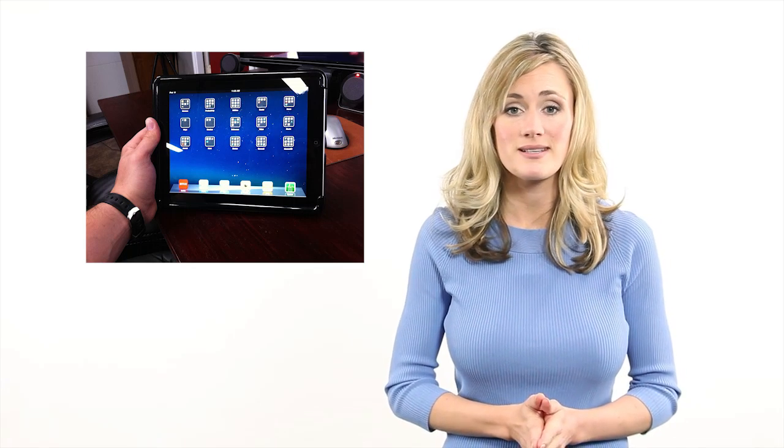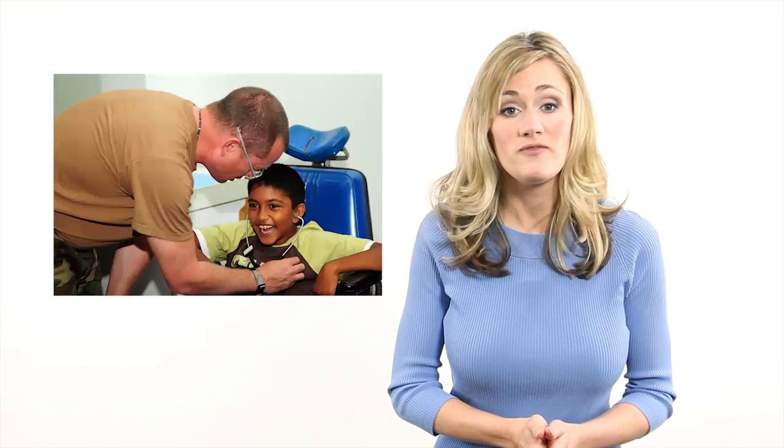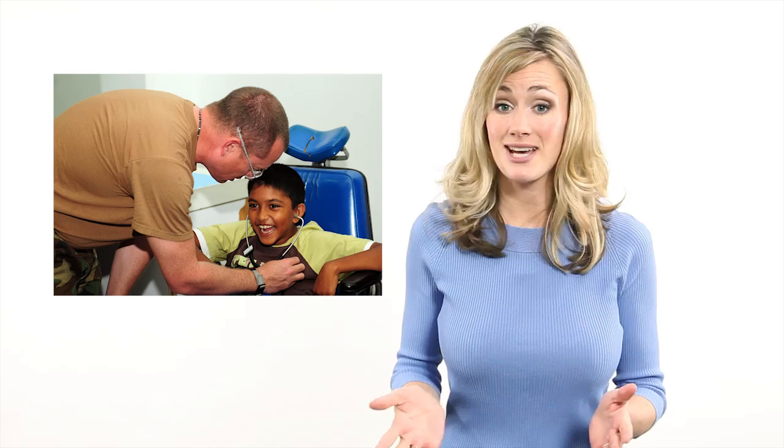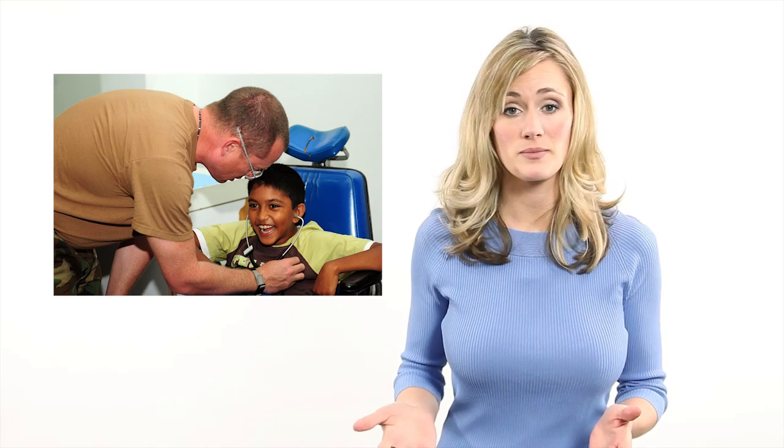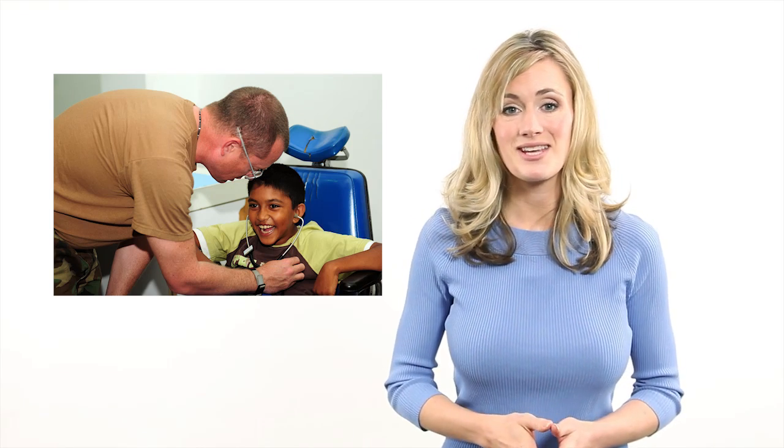More and more tech savvy people are switching to tablet and mobile devices, but for people with severe physical disabilities, ordinary touch screen gadgets are nearly impossible to use. But now engineering students at the University of Michigan have developed an iPad app for physically disabled users.